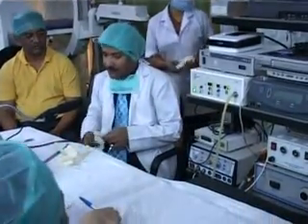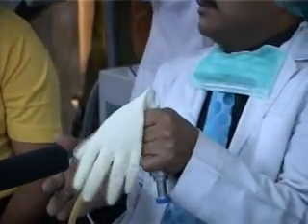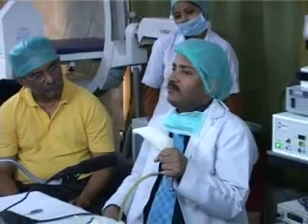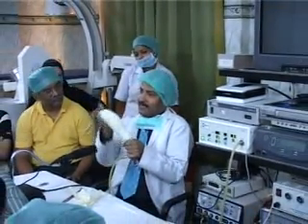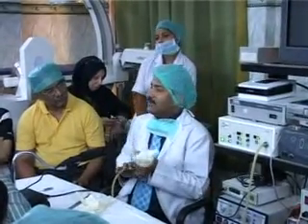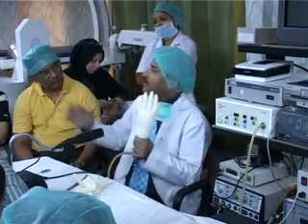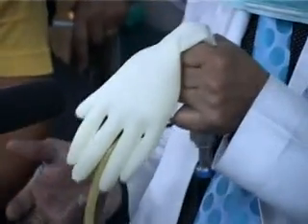Now, what you have seen here is that if there is a leak and you have set it to 1 liter per minute, it will take a lot of time for the abdomen to get inflated, and by that time you can have 1 cup of tea also. The normal time taken for Veress needle insufflation is approximately 5 minutes. 5 minutes is sufficient time. If it collapses, again you wait for 5 minutes, isn't it?